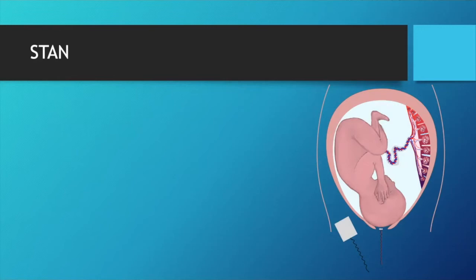Is the FSE enough for me to just figure out the baby's ECG to start with? No. You need the skin pad, the skin tag, to cancel out mum's ECG. So if you're doing an ECG, you always ask a lady to touch nothing, and not move as much as she can. You're trying to cancel out any dampening effect from whatever she's touching, and any electrical impulses coming from the muscles.